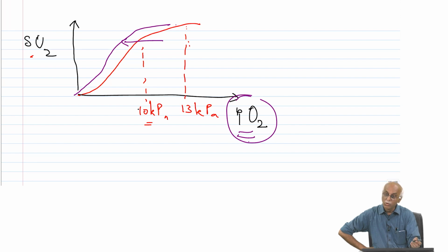So carboxyhemoglobin starts increasing, but the saturation parameter which is captured will not be able to see this information. Even with low oxygen in hemoglobin, it will still measure a higher saturation parameter. The oxygen level has decreased, but the saturation parameter is large.